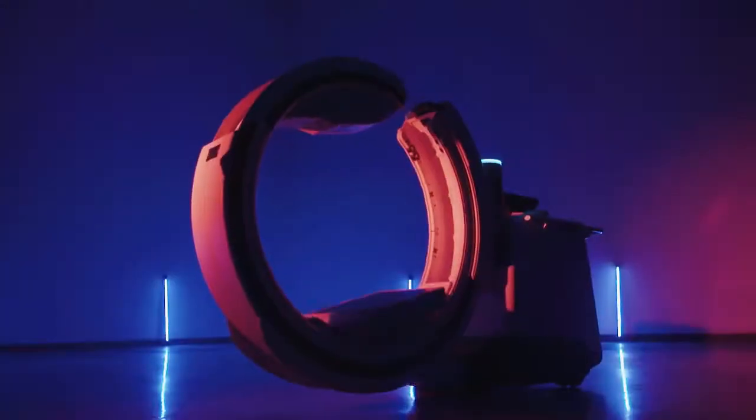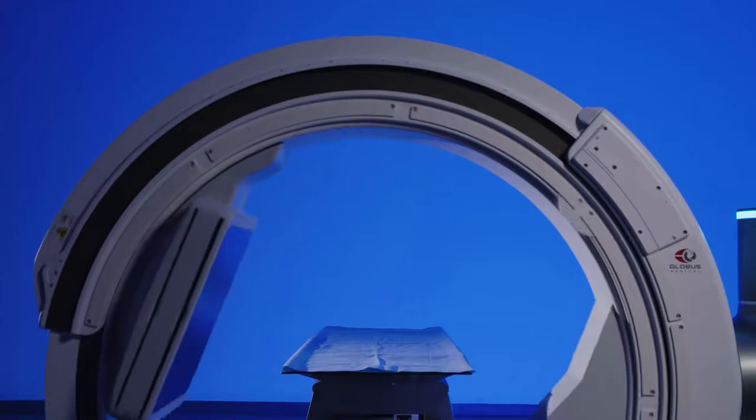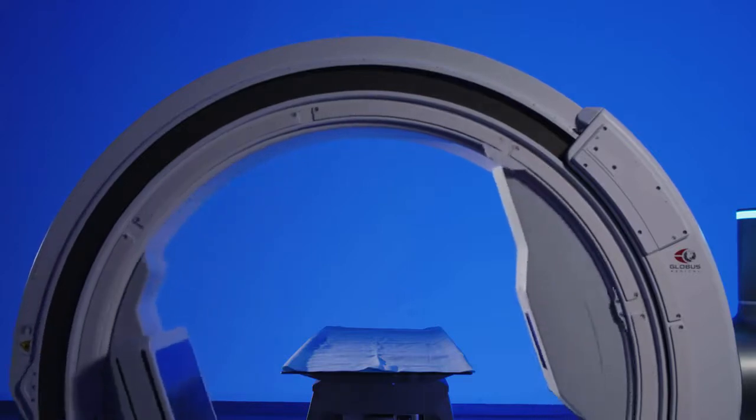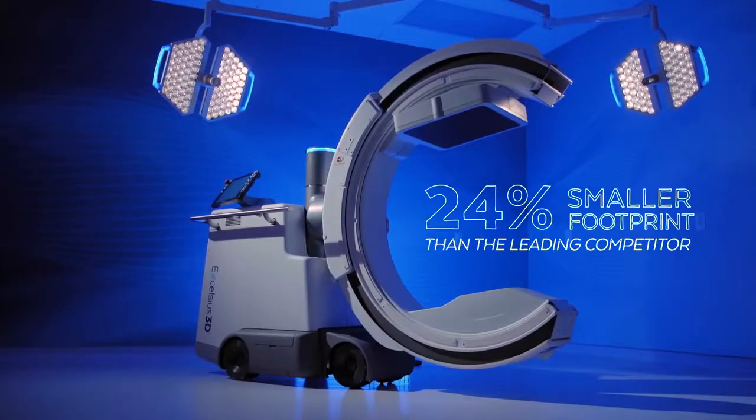Let's dive into the unique design and features of Excelsius 3D. The versatile base is compatible with all conventional OR tables and has a footprint 24% smaller than the leading competitor, allowing for simple integration into any room.